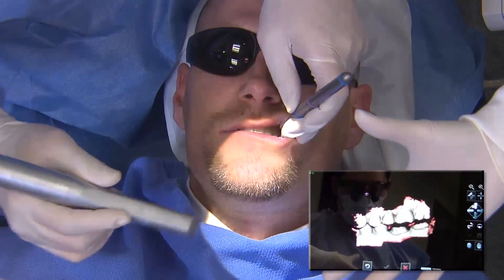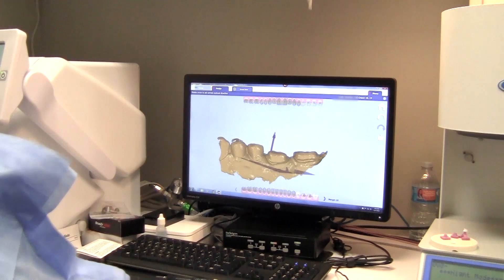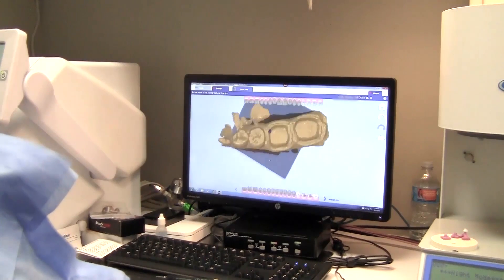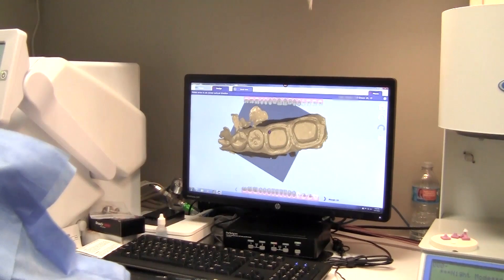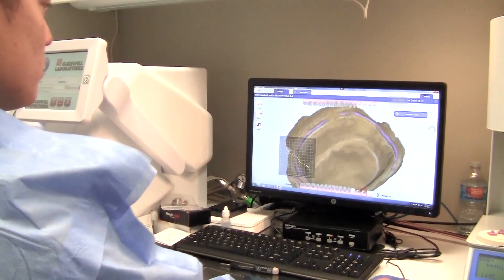Once the data is captured, the 3M True Def sends the model scans to the IOS fast design software. The first step is to set up the case, indicating the type of restoration — these are going to be full coverage crowns — then the type of material, which is Obsidian CAD. The shade selected is C3. The next part of the process is to determine the occlusal direction, which helps the software position the design proposals properly over the preps.